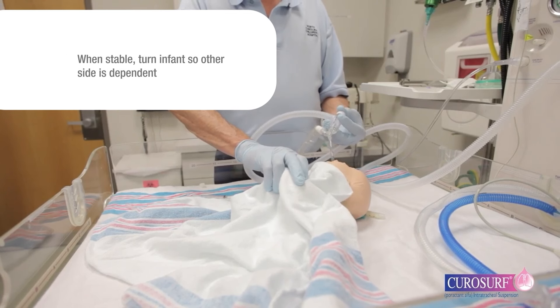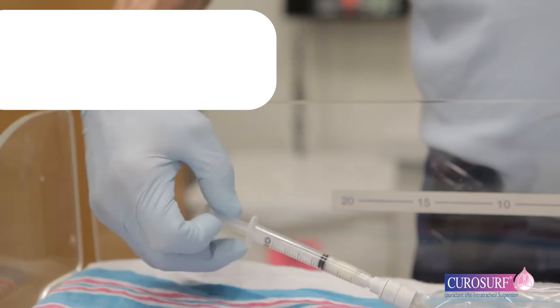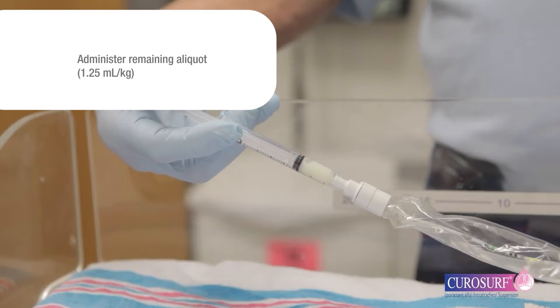When the infant is stable, reposition the infant such that the other side is dependent and administer the remaining aliquot using the same procedures as the first aliquot.